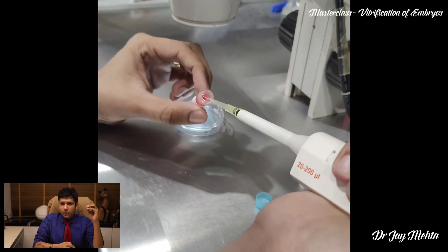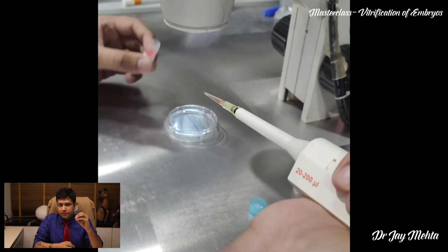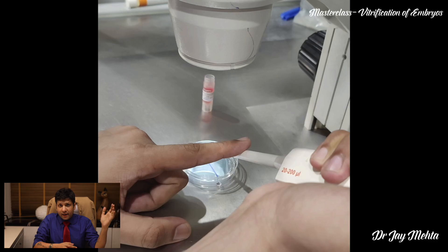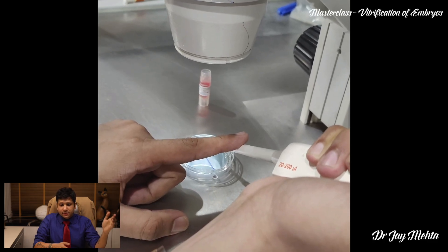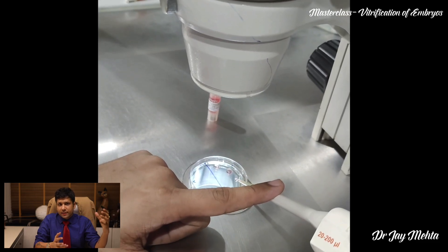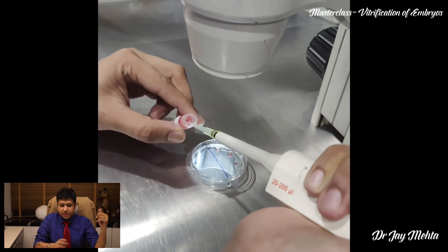The droplets of equilibration solution are taken on one of your plates. The plate should not be at 37 degrees — that is something which is important. The average size of the drops which we take is going to be around 35 microliters.